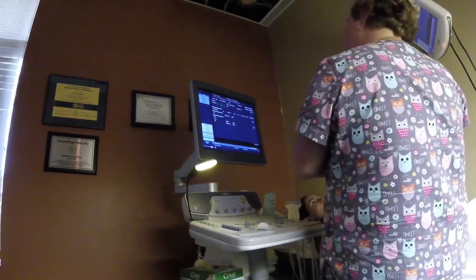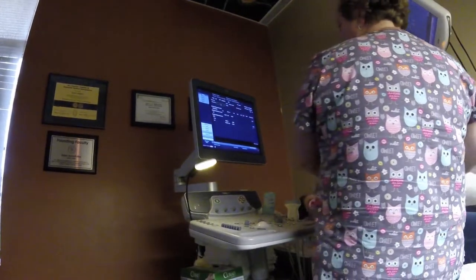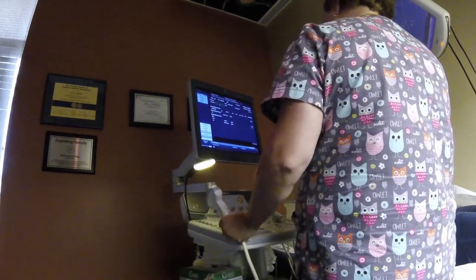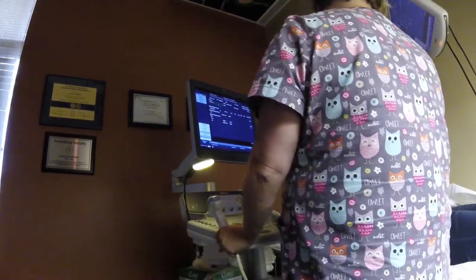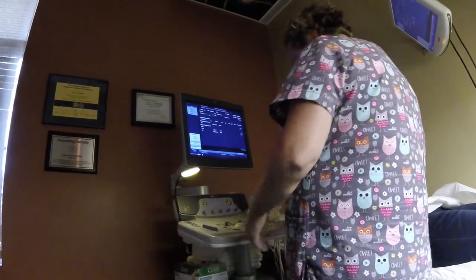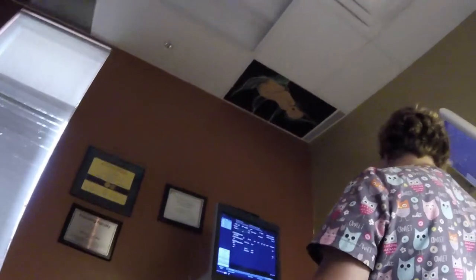So baby today is 2.8 centimeters, and measuring 9 weeks and 4 days. According to your last period, 9 weeks and 3 days, so basically they're not going to change your due date based on that. The heart beats 170 beats per minute, which is normal, and that's what you want. The next time you count, it could be down to almost 150. It just depends on what the peanut's doing in the oven.